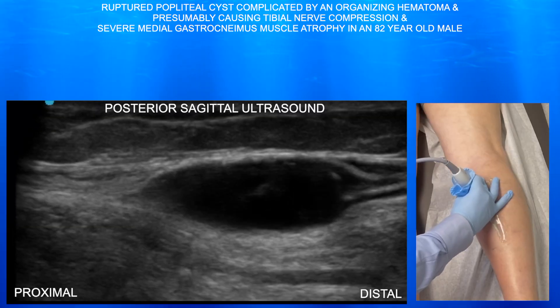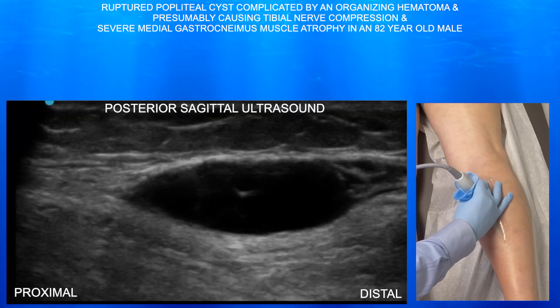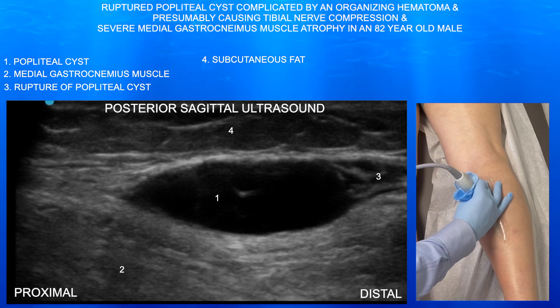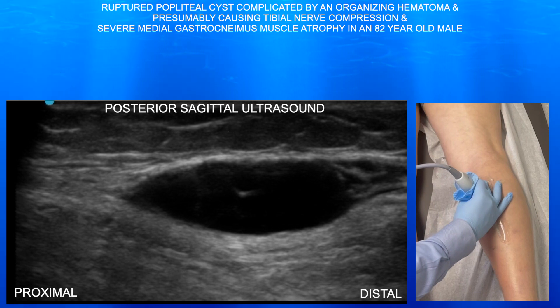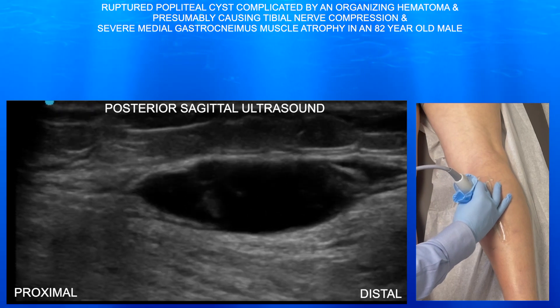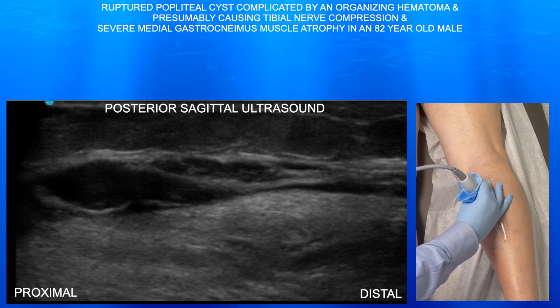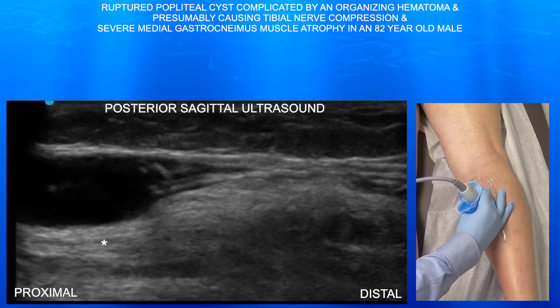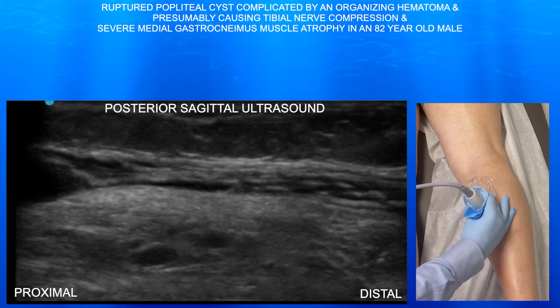Here we're looking at this popliteal cyst in a sagittal plane. You can appreciate that there is a rupture of this cyst at its most distal pole. You can see the fluid tracking essentially in the subcutaneous tissue and subcutaneous fascia. It's lying right over the medial gastrocnemius muscle, which is hyperechoic, consistent with atrophy.